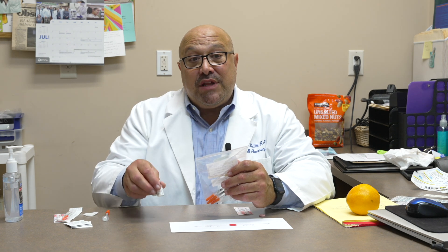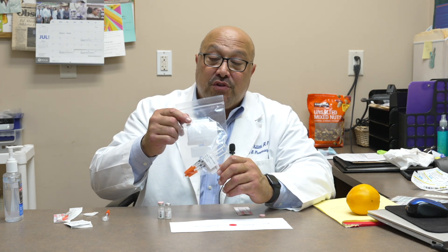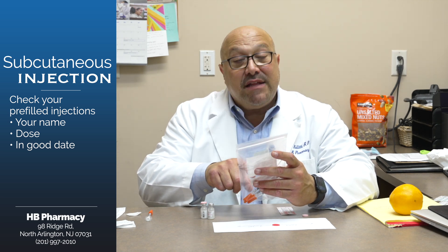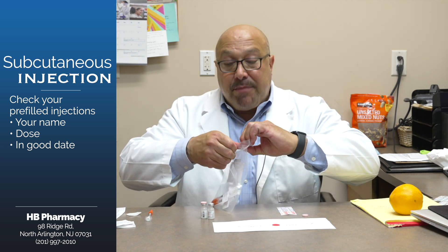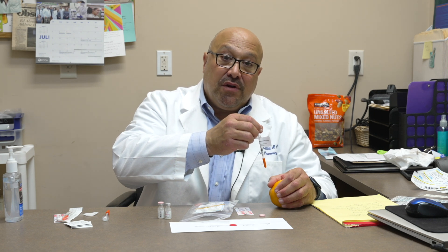As I showed you, sometimes things will come in a vial and you have to carefully withdraw the correct amount of medication into the syringe prior to injecting. Other times you'll get your medications in a pre-filled syringe, either from a manufacturer or from our lab. With a pre-filled syringe, make sure it has your name on it, states the dose, and is within date. You skip the vial steps and go straight to preparing the injection site: alcohol first, let it dry, pinch the skin, remove the cap, and go in at 90 degrees.